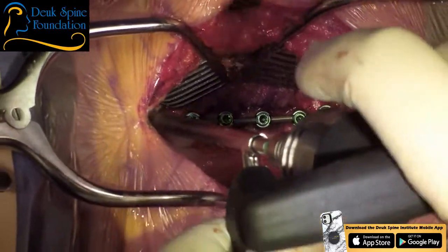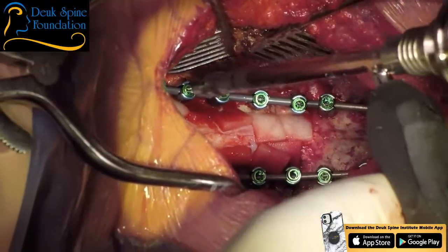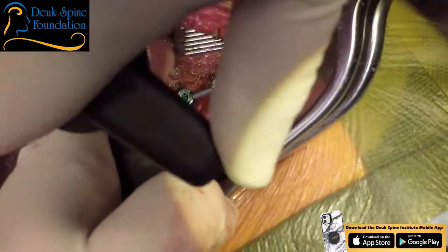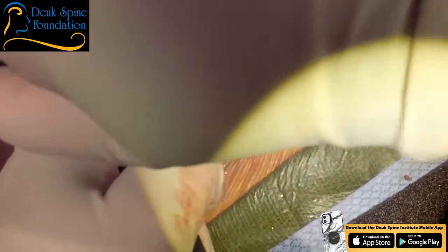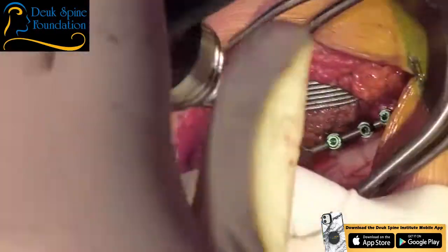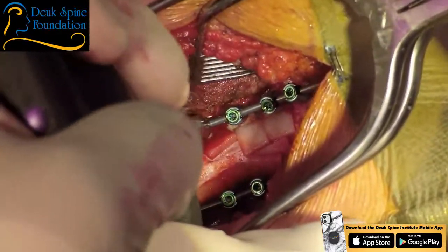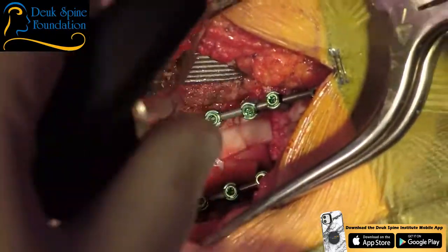The key is you don't want the driver to slide up, and it's really easy to strip, as you know. When you got stainless steel versus titanium, the stainless steel always wins. Stainless steel is a much harder metal, so you want to be really careful as you do this, not to allow movement. All right.